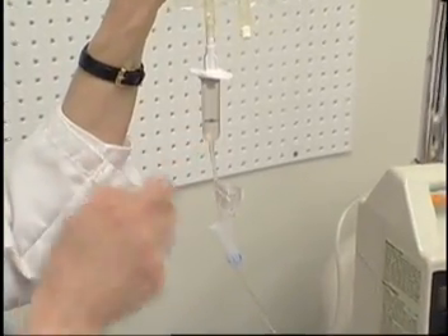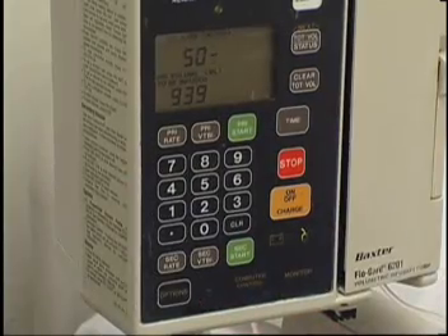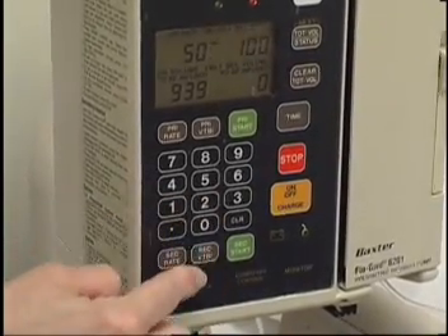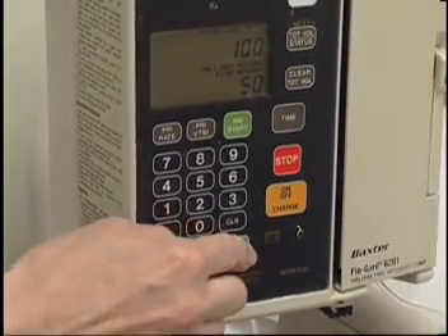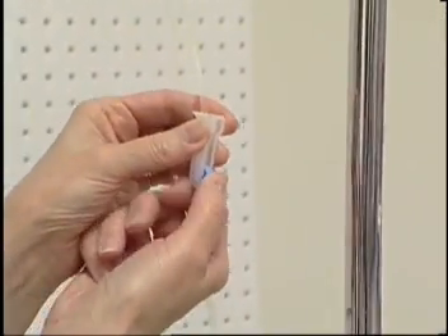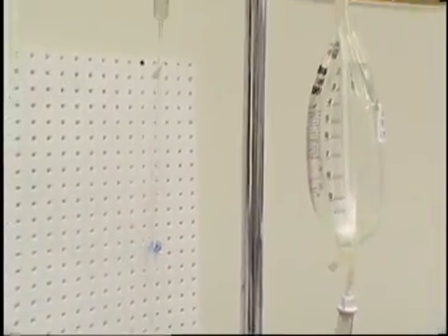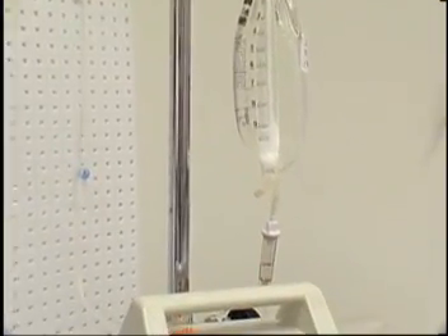Clamp the secondary tubing. Program secondary settings into the infusion device. Open the clamp on the secondary bag tubing. Check that the primary infusion resumes at its set rate after the secondary medication has infused.